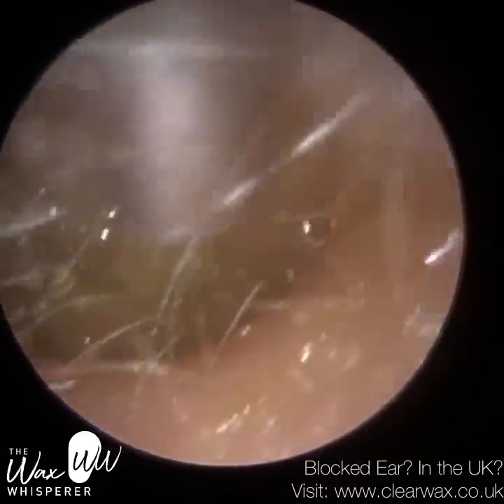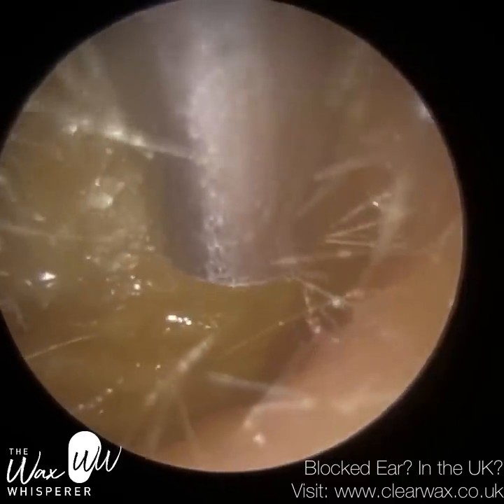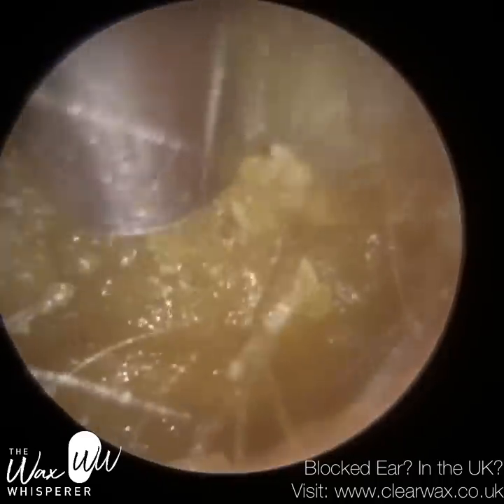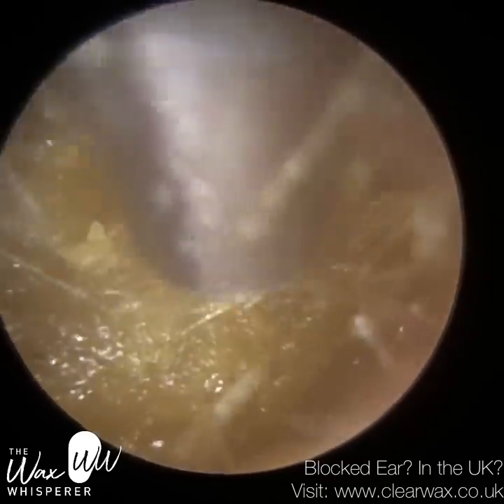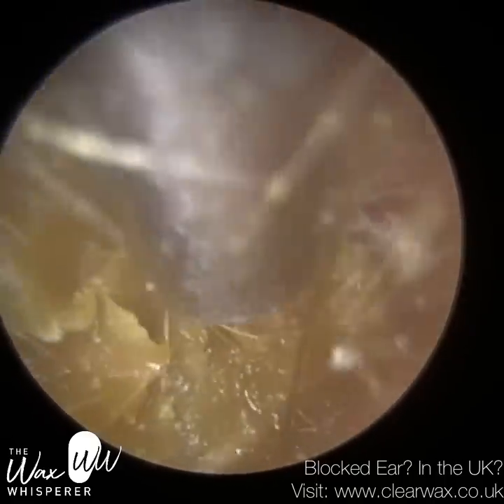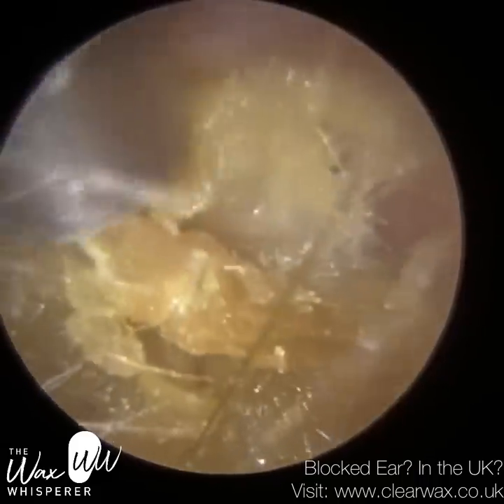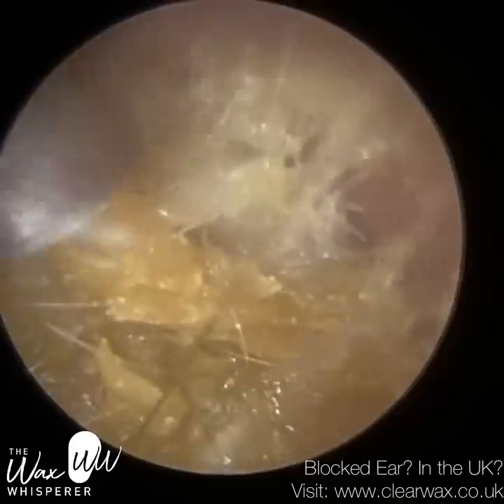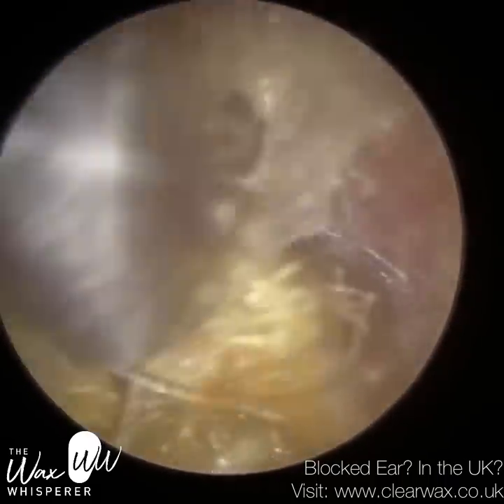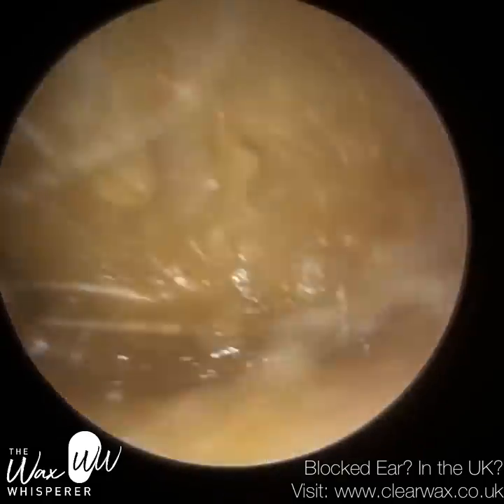Sometimes less is more — something I've had to learn over the years. No matter how much you want to clean the ears, sometimes it's not worth the risk; by trying to get every last speck out, you can do more damage than good. There's sticky residue around the edge that would require scraping the canal wall to remove, and we don't want that. Patient comfort is the most important thing when removing earwax. I know firsthand from our Clearwax training courses how uncomfortable contact with the bony canal can be.